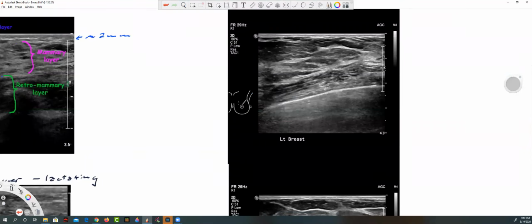Okay, here we cannot call this sagittal. We see by this body mark, this is your transducer, and what the technologist is doing is they're going to move this around the breast. But what they've done, this is rad, as in radial.